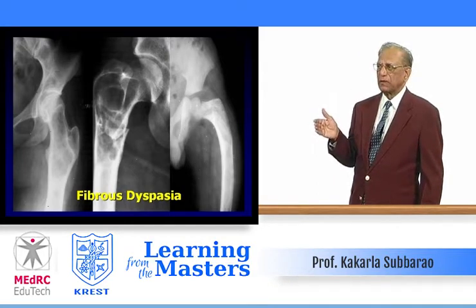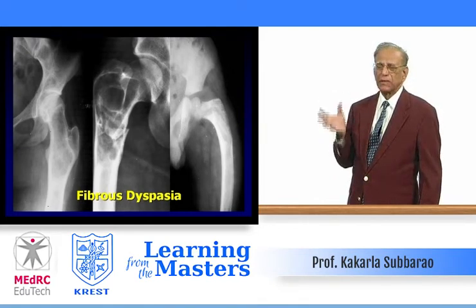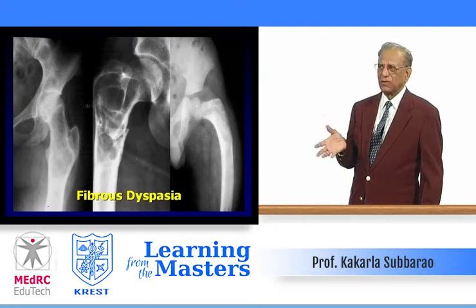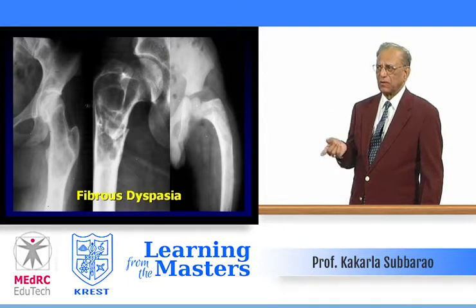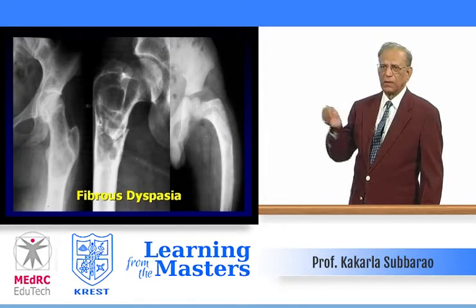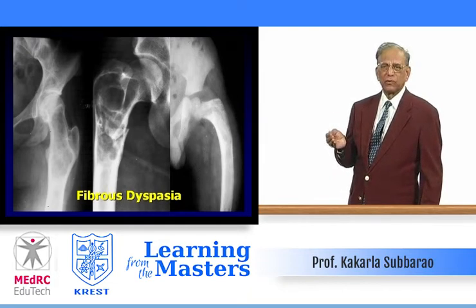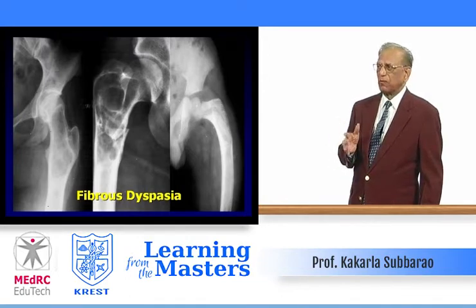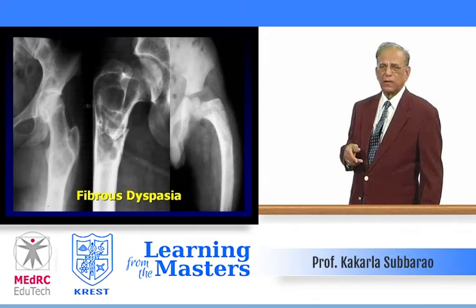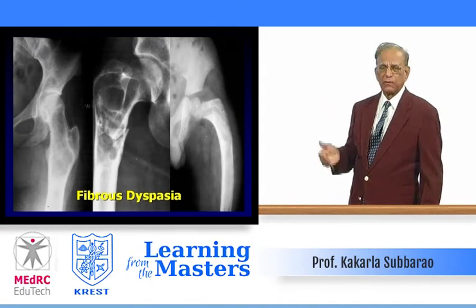For example, the middle picture looks like a cystic disease — a solitary cyst or aneurysmal bone cyst — but it is neither. If you look carefully, it is expanding and appears aggressive, but the margins say it is benign. Look at the matrix — it is smoky. So it is fibrous dysplasia with a fracture; repeated fractures may remodel part of the bone. The rightmost image shows the shepherd's crook deformity in a three-year-old child, with deformity and increased bone density with a smoky matrix.